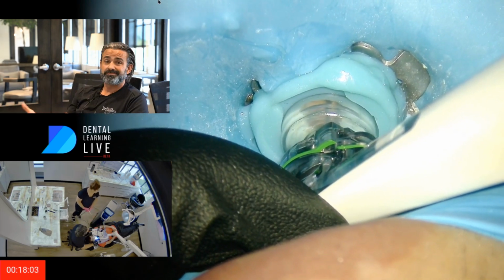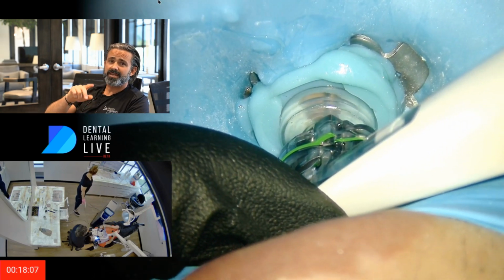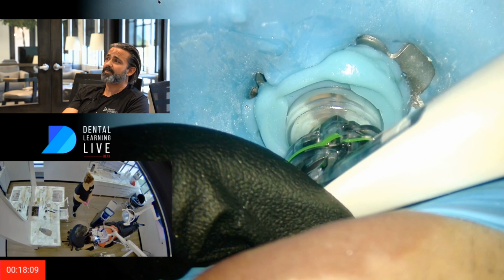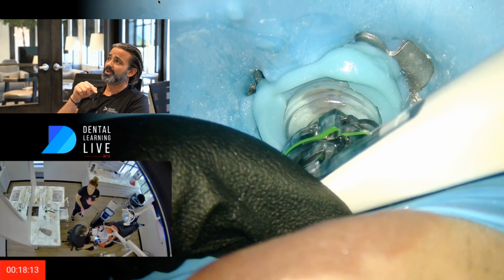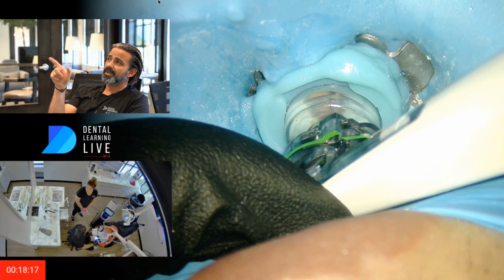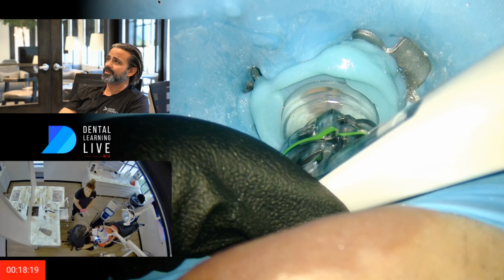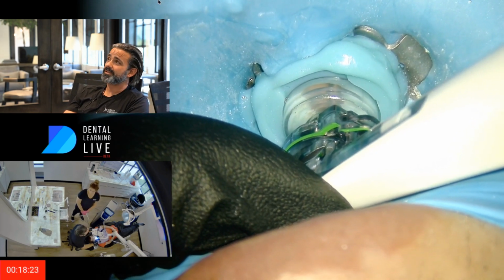If you have to, just go back on the video, rewind it, watch it again, pause it, and pay attention to that space. Because when we're done, I want you to pay attention to the space after the GentleWave and what it looks like. It's a really cool thing to look at, because I didn't file that. That's my point.